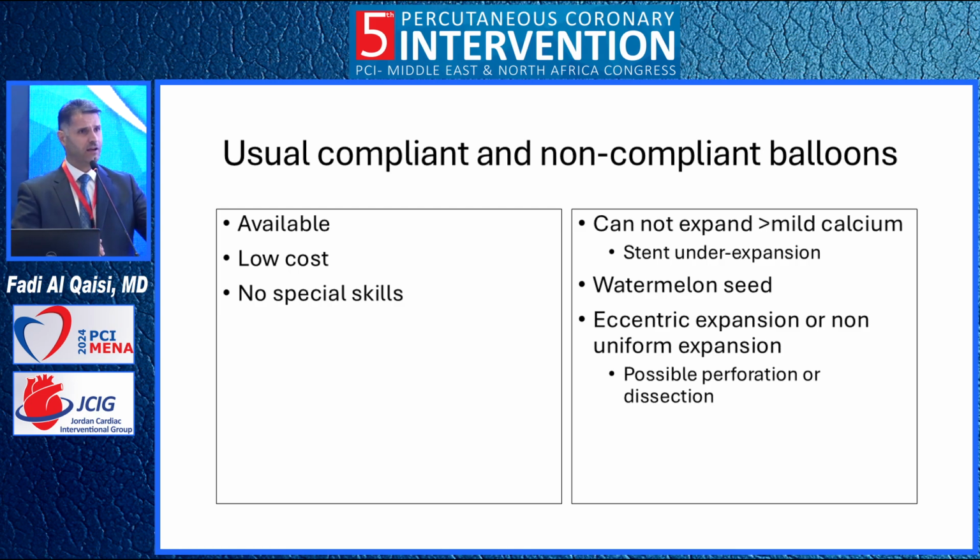Compliant and non-compliant balloons, advantages on the left side, disadvantages on the right side. Advantages, it's available. It's low cost, it doesn't need any special skills. Disadvantages, it does not really deal better with more than mild calcium. It can manage mild calcium. Otherwise, you are going to end up with stent under expansion. It has the watermelon seed effect, where the balloon slips inside the artery, and it has the trick of eccentric expansion.